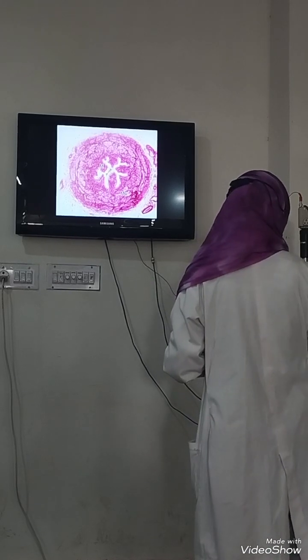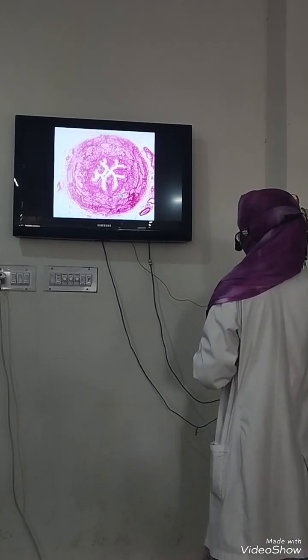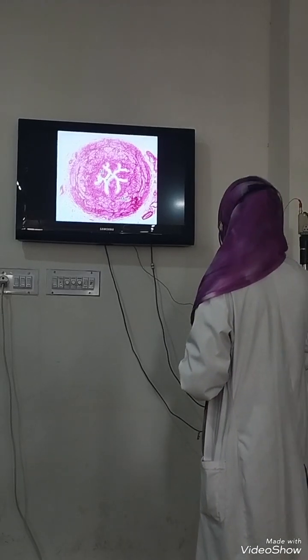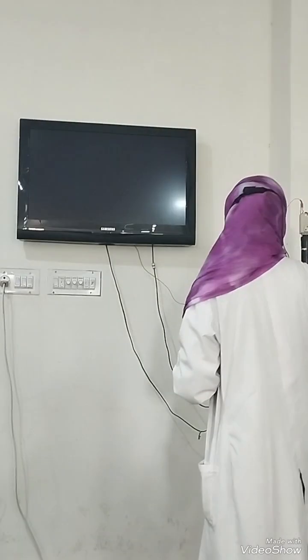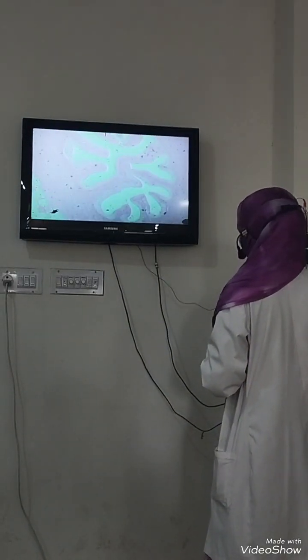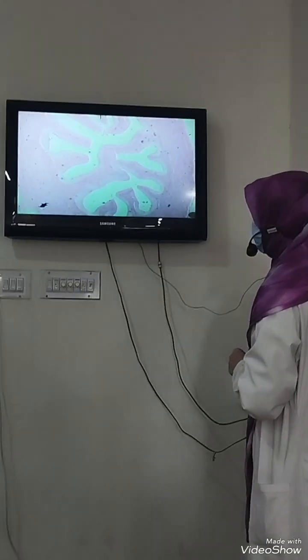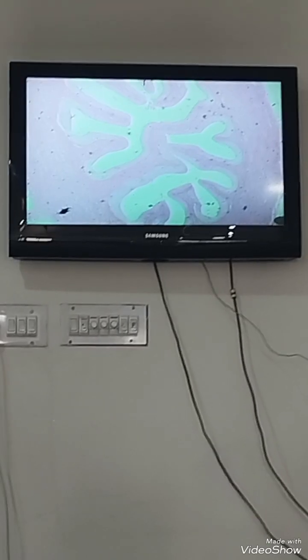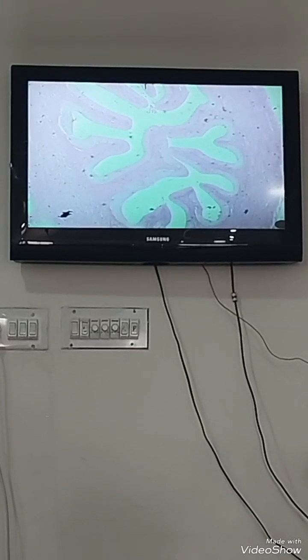Okay. So now after that we have to switch towards the histological actual slide. So kindly focus. Take a zoom out view. So it's a beautifully starry appearance of the lumen of the ureter. You must have learned this in the first year as well.